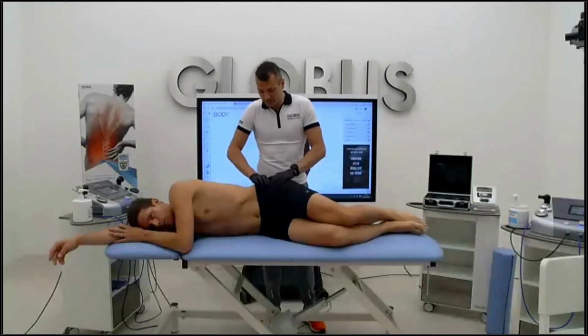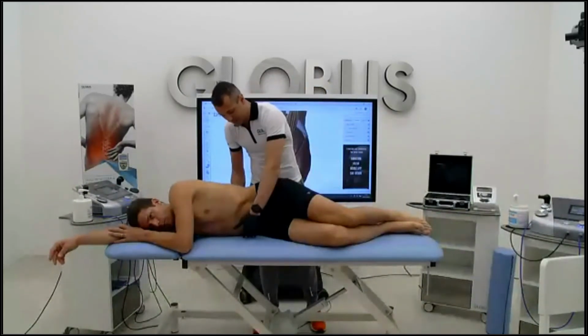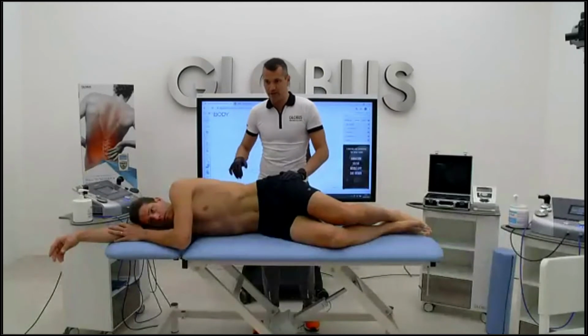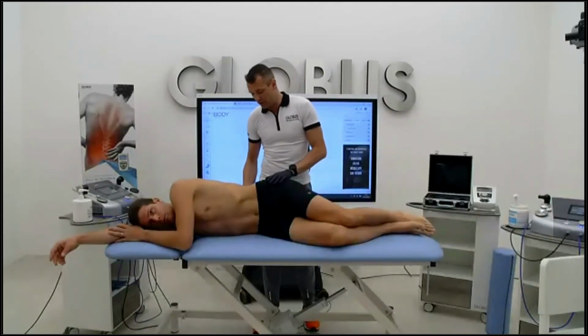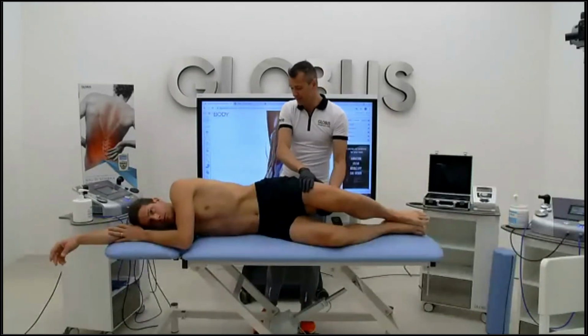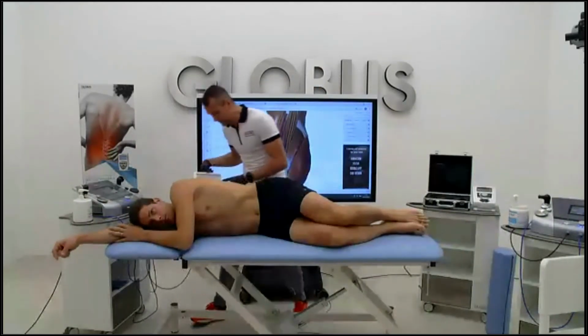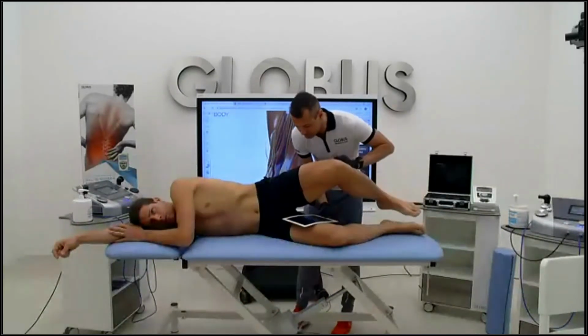Well, the positioning could be the same. We can put the plate under here or under the belly here. Depending on the shape of the body, if there is a hollow, I recommend putting it, like Diego also said, just here in the middle. Okay, let's have an example. So we put the plate here in the middle.